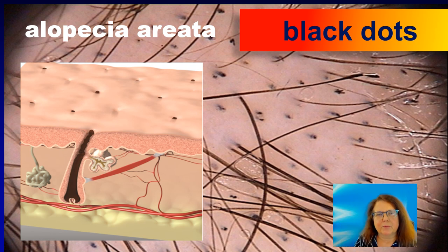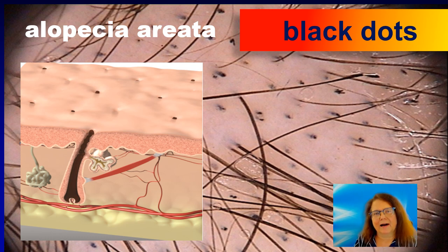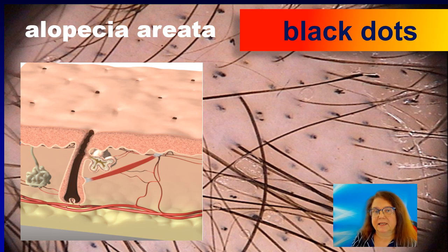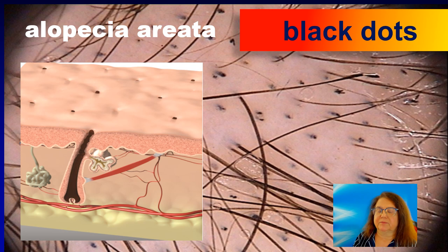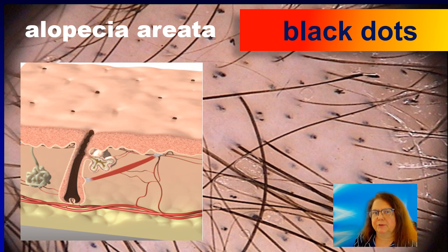In this image we see the typical black dots in trichoscopy. Are they typical for alopecia areata? Yes, they are. Are they specific for alopecia areata? No, they are not. There are many diseases in which black dots may be present, including other types of anagen effluvium, but also trichotillomania, and even sometimes black dots may be present in patients with cicatricial alopecia.